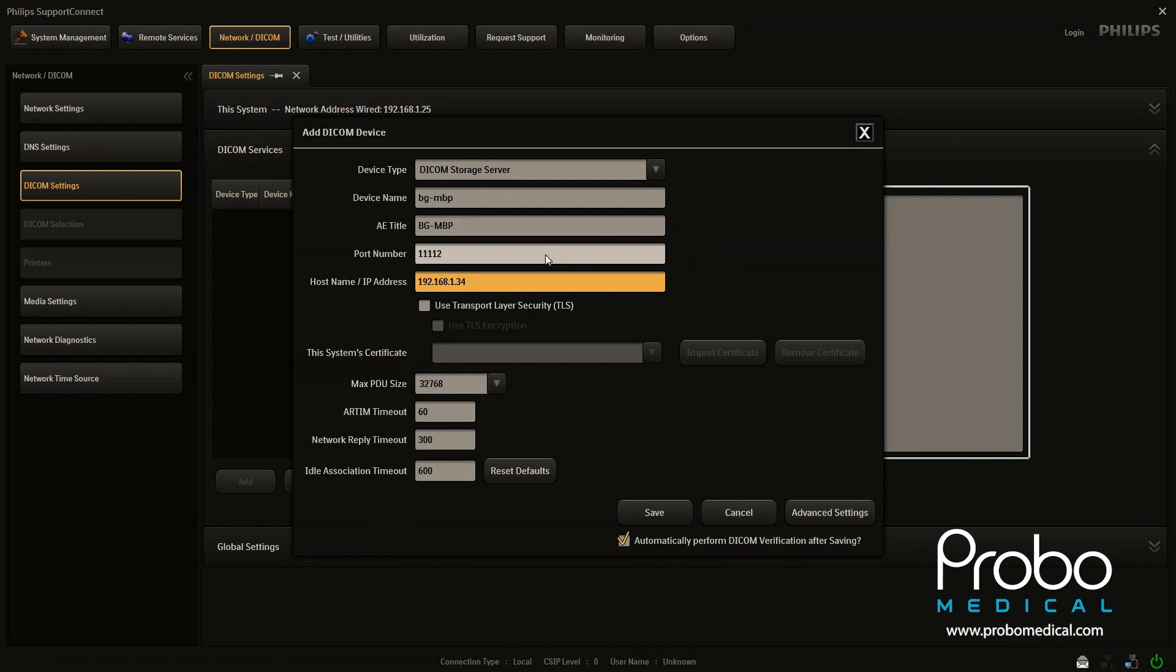Next is the port number. And as well, same thing. Same thing as the AE title that's going to be given to you by the PACs provider.